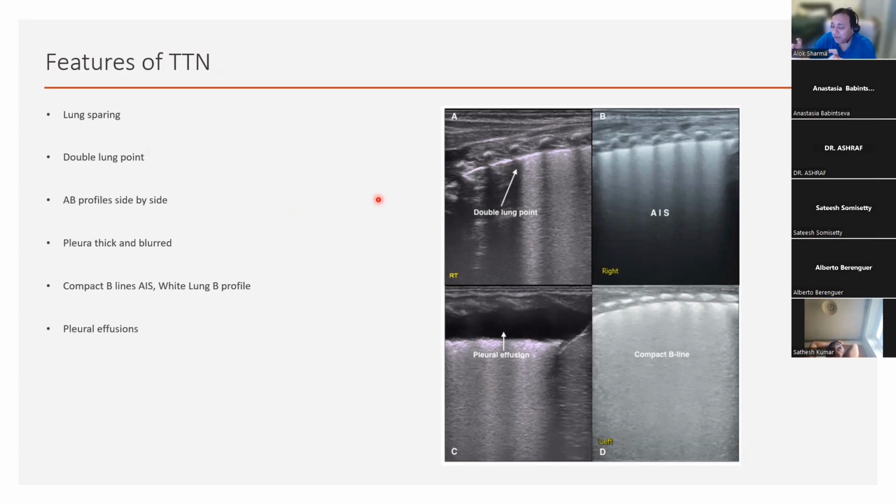So there are slight differences. For me, what is very important, again, is that you're looking at the underlying diagnosis and the clinical course, because naturally, if I see an effusion accumulating after a diaphragmatic hernia repair, I'm not going to tap that. In my career, probably only once have I ever tapped it. So really the question is, if the baby's completely stable, I wouldn't be doing a lung ultrasound anyway. But if I did a lung ultrasound because the baby was deteriorating and I found an element of effusion in that area with a diaphragmatic hernia, logic would say that that's a post-operative collection. Any other questions?